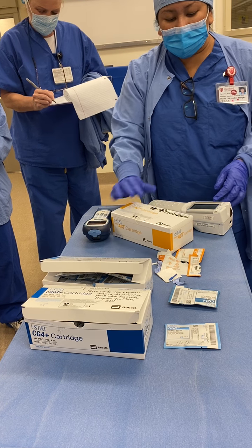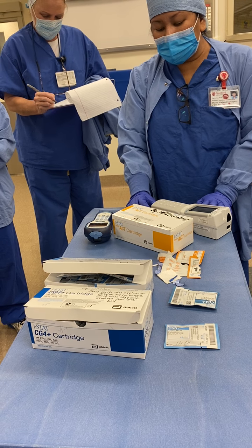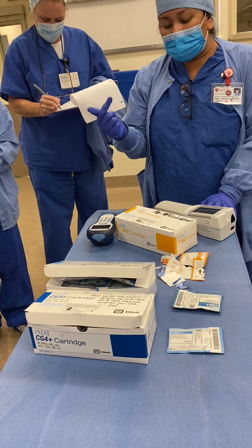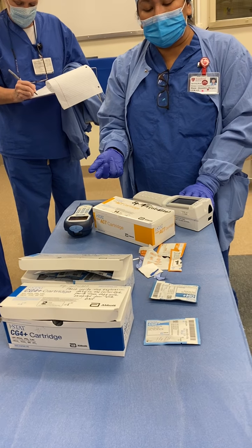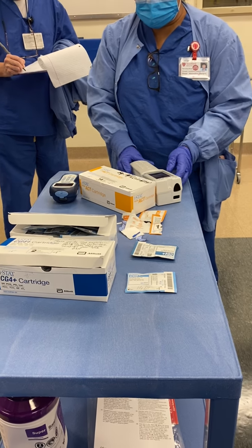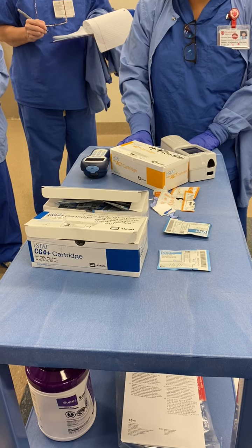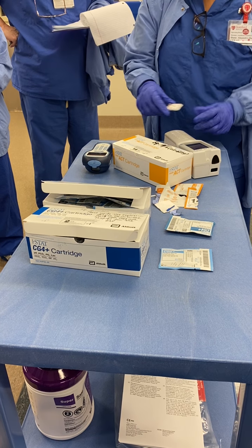The reason why is they need to know if they need to give anticoagulant to the patient. If there are issues with their clotting, do they need to give them clotting factors? So cardiac surgery will use this, liver transplant surgery will use this. And then once this is done, it can be tossed away, okay? So it's only for clotting purposes. Activated clotting time, that's all this does, okay?